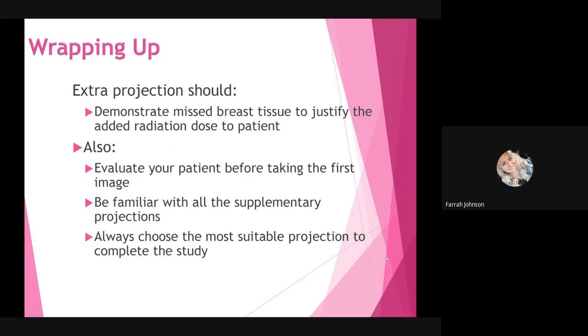Okay, and then wrapping up, the extra projection should demonstrate missed breast tissue to justify the added radiation dose to the patient. So anytime you're using any of these supplementary views, they should only be used to evaluate breast tissue that was missing on your existing mammogram. You also want to make sure that you evaluate your patient before taking the first image. Be familiar with all of the supplementary projections that we discussed, and always choose the most suitable projection to complete the study.